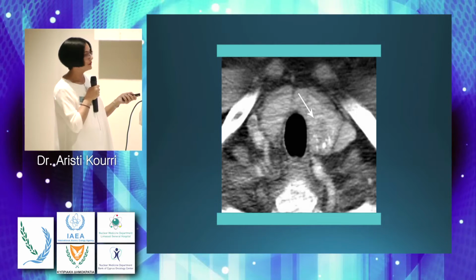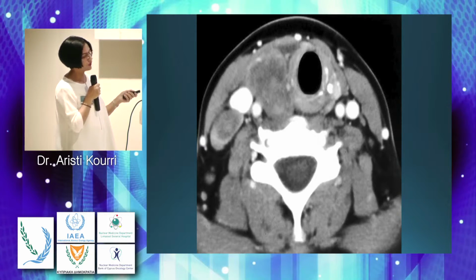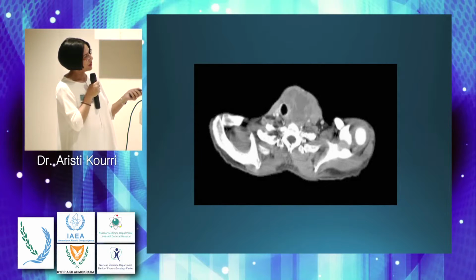This one is malignant. It has calcifications. We already did a biopsy. The CT was for staging. This one is a follicular cell carcinoma. As I said before, it was already biopsied, with a metastasis. As you can see, the metastasis has similar features to the tumor in the gland. This is a stage 4 disease, local spread. You can't say if there is any anatomy left, it's just displacing the vessels, nothing more.